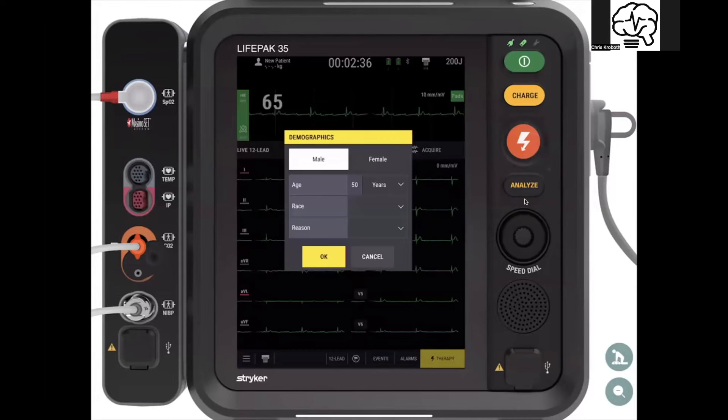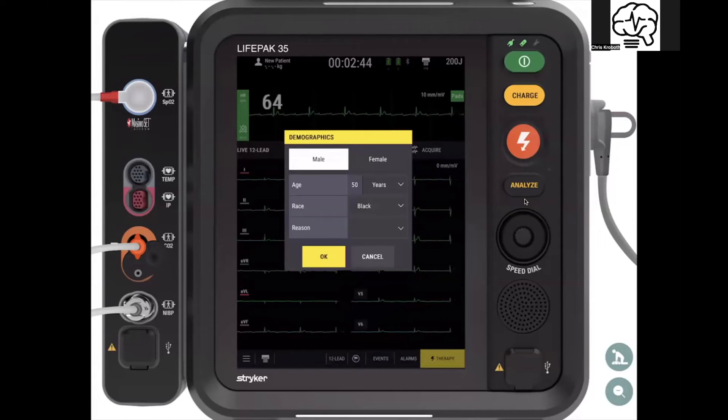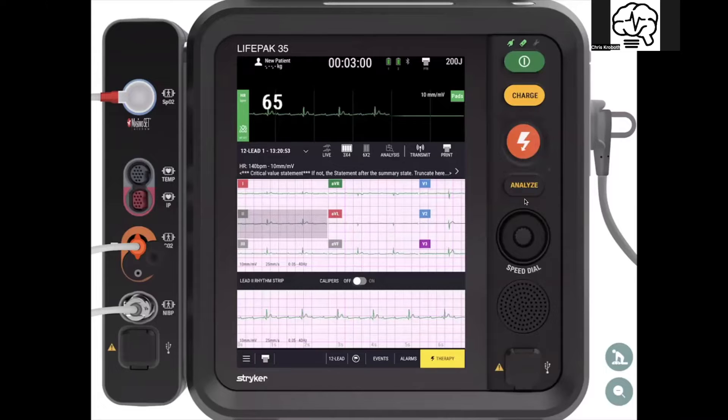You go in to acquire and it still uses the Glasgow algorithm, requiring age and sex. You'll see ethnicity added in, and the newest version of Glasgow is built into the system. Acquire your EKG — it analyzes and brings it up into this really awesome dashboard where you can cycle through the individual leads. An even cooler feature is you have calipers built in.